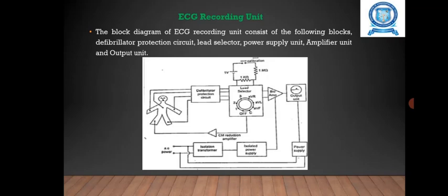Then here you are using a calibrator. Using this calibrator, a push button allows insertion of a calibration signal to calibrate the recorder. In this diagram, you have the bioamplifier. The bioamplifier consists of a preamplifier and the power amplifier. Using the preamplifier, you can set the gain with a switch. It also avoids problems with small DC voltage from the polarization of the electrodes.